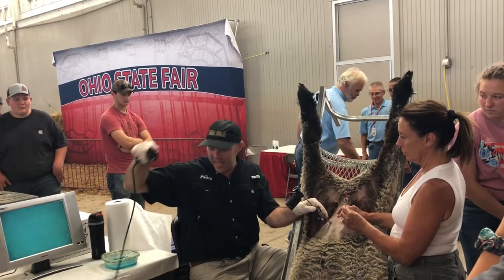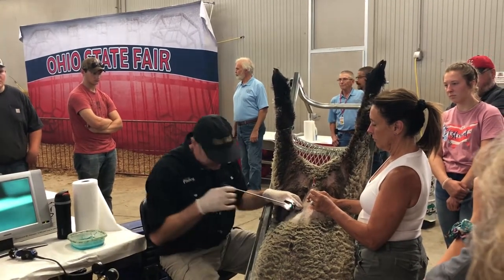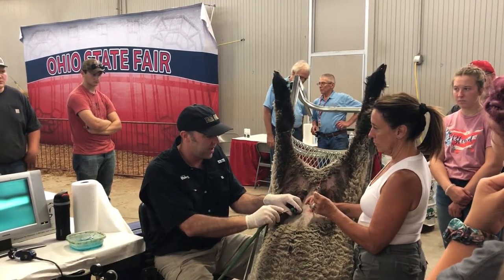I'm not as good with the camera breathing as I am with my eyes. I lost a little bit of air because I was talking too much, so I've got to air it up a little bit.